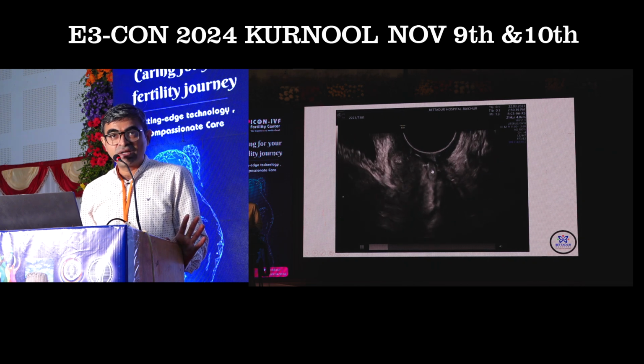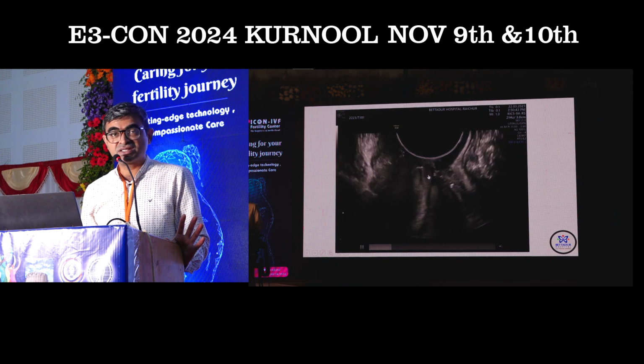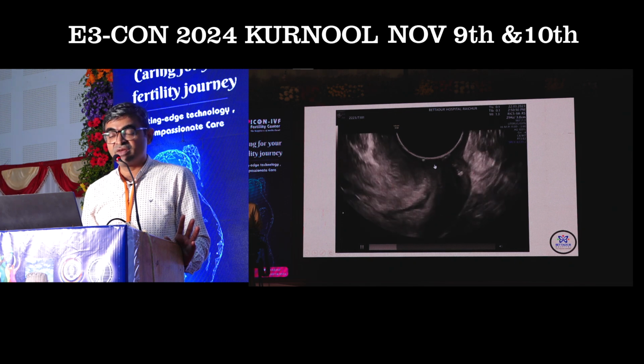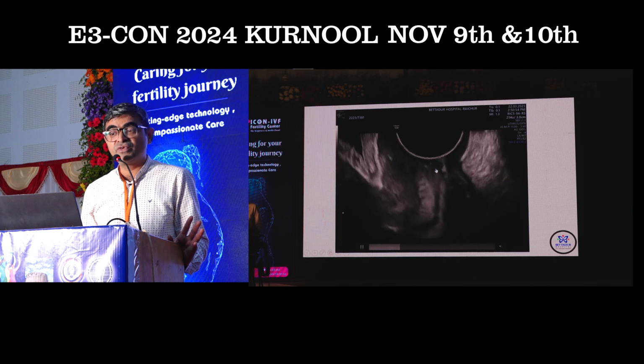So now you got the diagnosis. Yes, because I was doing it slowly and trying to assess the cervix, I'm able to get this lesion. Somebody will say, okay, what is there if I do a per speculum examination? I always do per speculum examination for every lady. I will definitely not lose this. So why is my imaging going to differ from theirs?